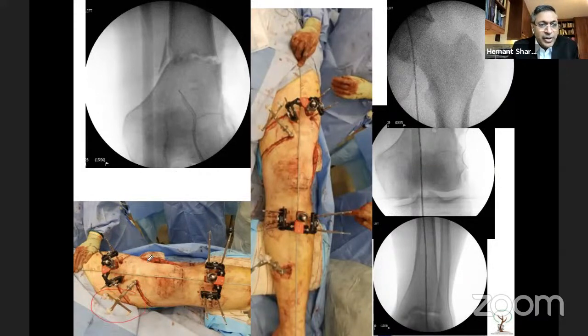I do the osteotomy and then make the leg straight. And once you make the leg straight, it has a long rod like an LRS, and this is the diathermy method. I've checked my alignment on the patient, and once I've done that, I hold the leg and then put in a rod and just hold the rod.